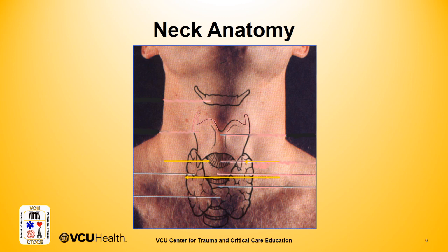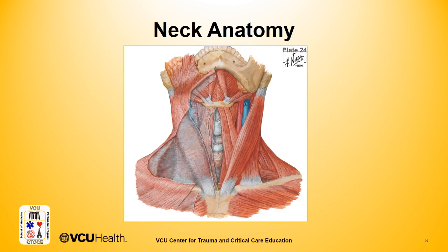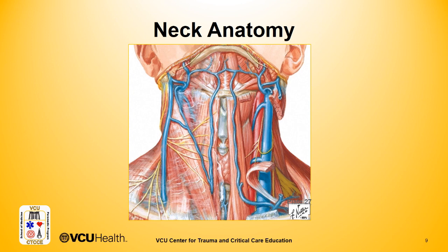Vertical incision through the skin will then bring you through the layers, and this includes staying in the midline. The next layer down is the platysma, making sequential vertical incisions in the midline through this layer, through the center of the strap muscles. All of these incisions should be vertical incisions. The reason that we do vertical incisions through the layers is because the major blood vessels in the neck run vertically. You want to keep your incisions in the midline vertical through the layers until you reach the larynx.